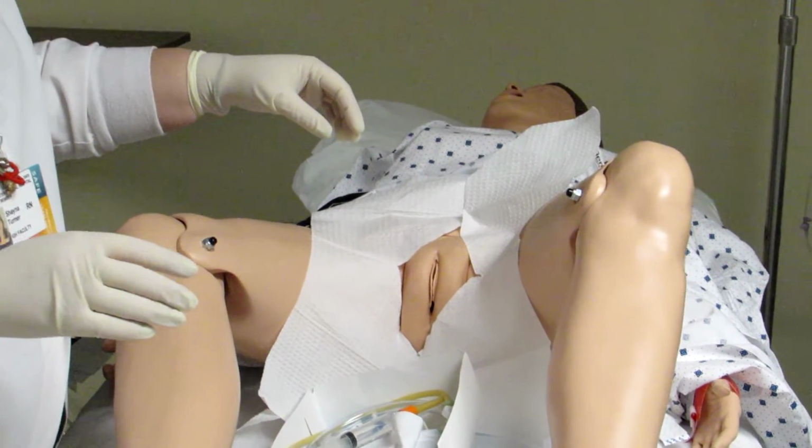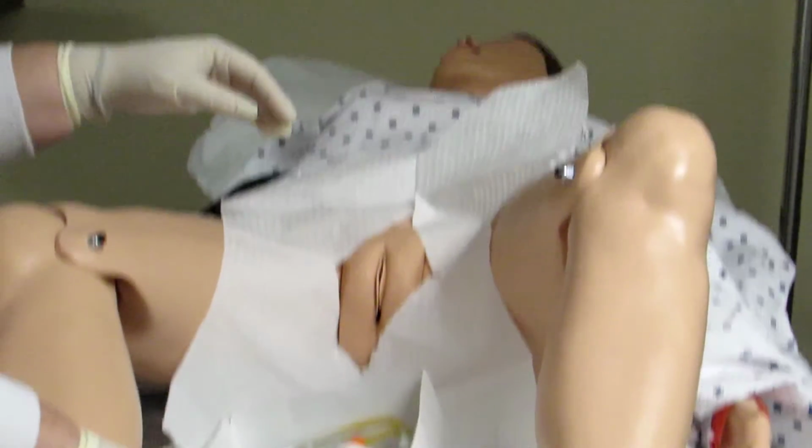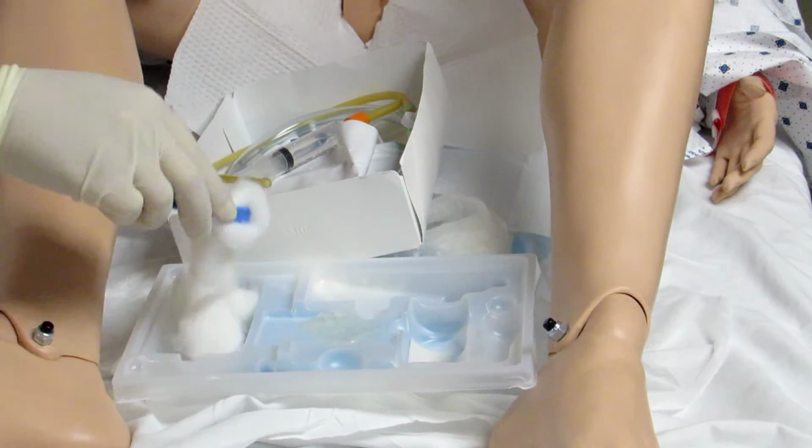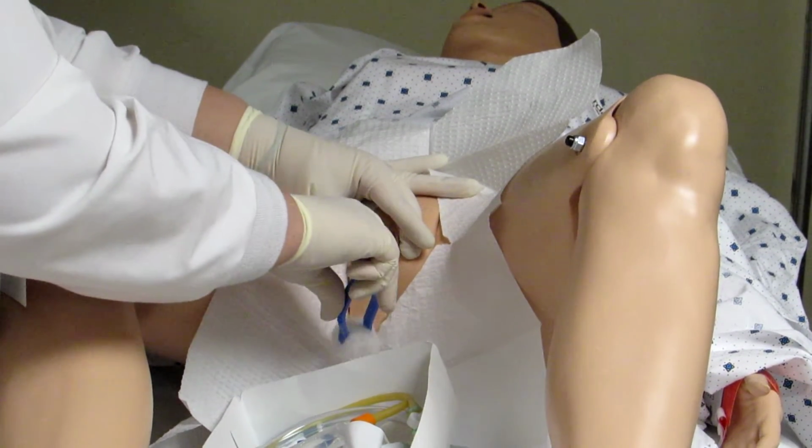So I'm going to tell my patient, Mrs. Johnson, I'm going to just clean the area. It might be a little bit cold. I'll let you know before I'm going to do the insertion. I'm going to grab one cotton, spread the labia, clean down one side, and then I'm going to drop it right here.